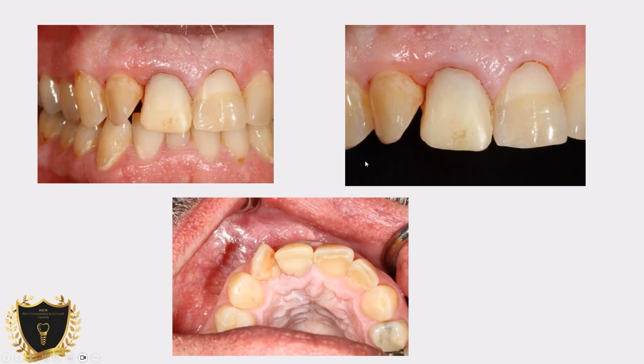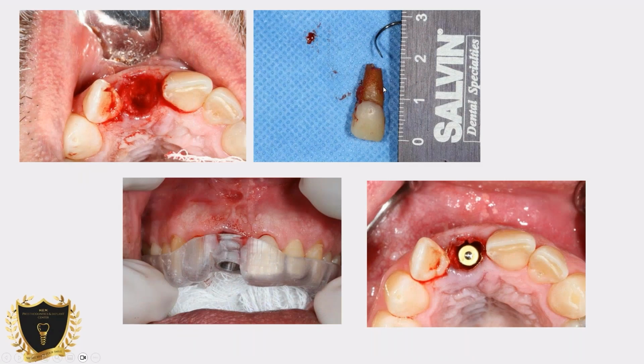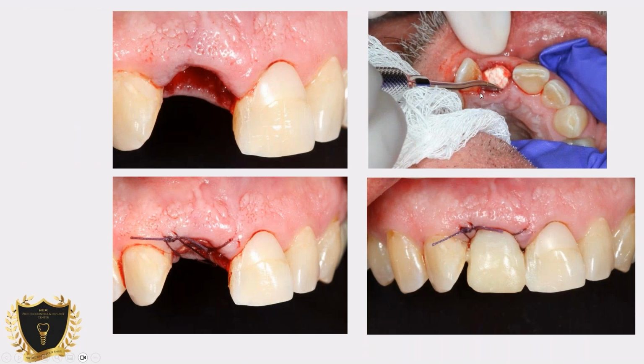So this is basically the tooth pre-op. You can see there's a rotation, so we decided to do a crown. Very challenging case because the patient did not want to extract it, did not want any other restorations. Ideally I would have preferred a crown on the anterior teeth or veneers to fix it, but he said, I just want this fixed, and if you want to fix it for the sake of the implant, just do a crown over there. So a little compromise decision, but we extracted the tooth, used the guide to immediately place an implant. The torque was not enough to load it, but good to place. Let it heal, closed it, sutured, and put a temporary, just using the same tooth and bonding it over there as a temporary to maintain the site.